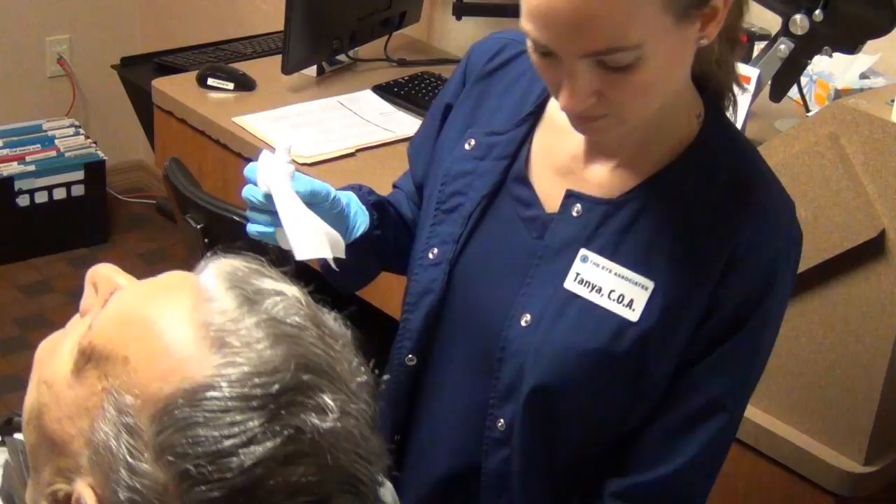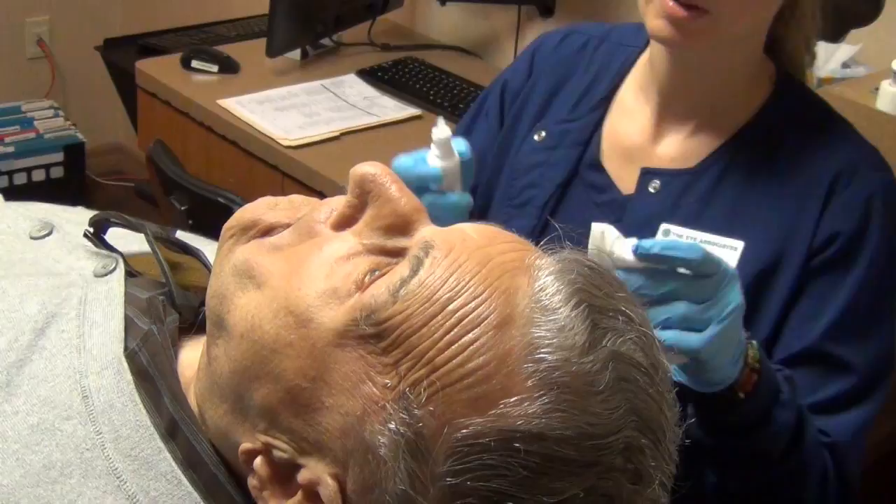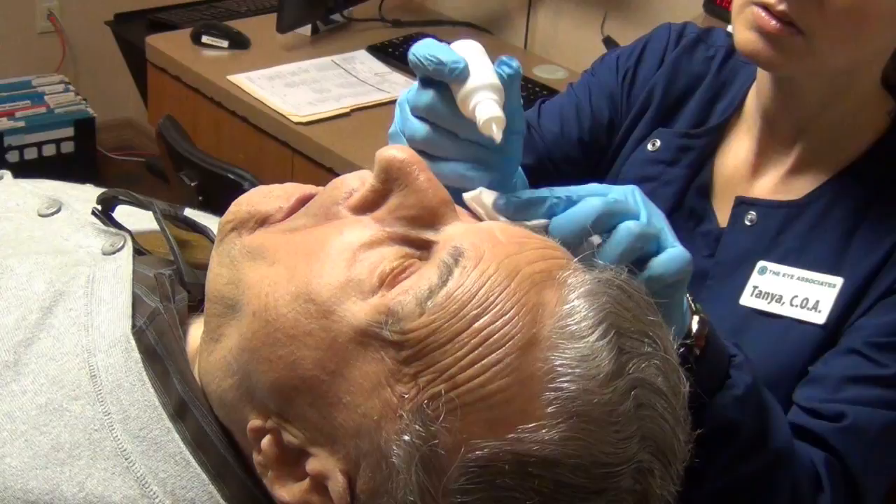I'm going to lay you back. So Tonya's getting Robert ready here. We like to make sure that all patients are nice and numb — that's always important, right Robert? We don't want you feeling anything. I'm going to do some more numbing drops here — go ahead and look up, some more numbing drops.